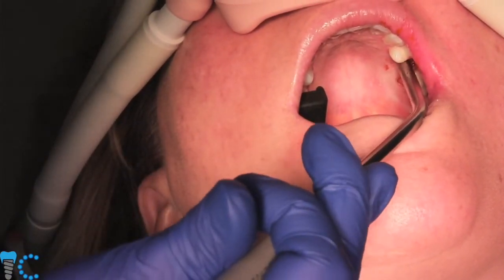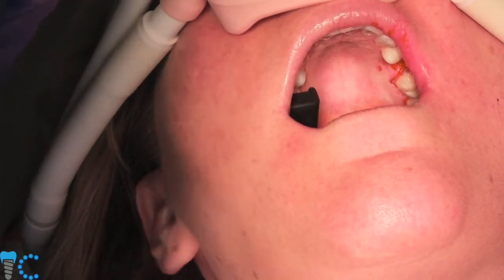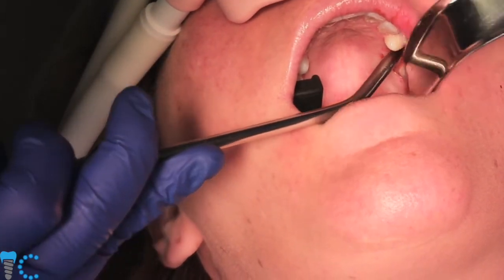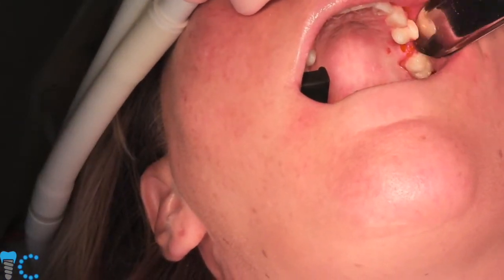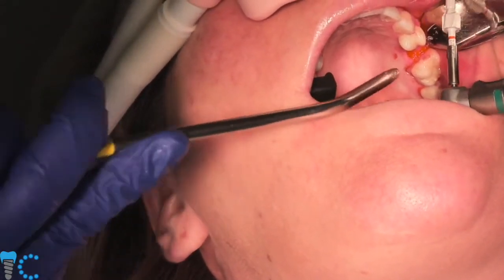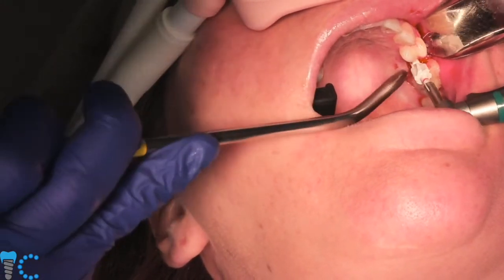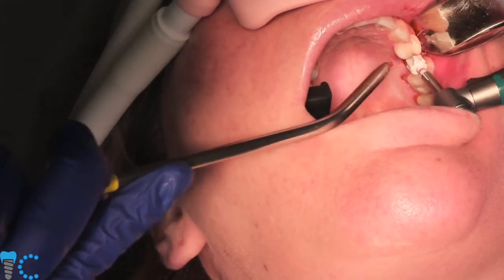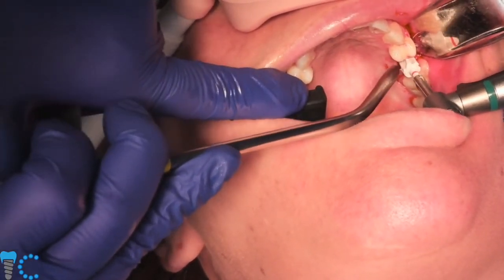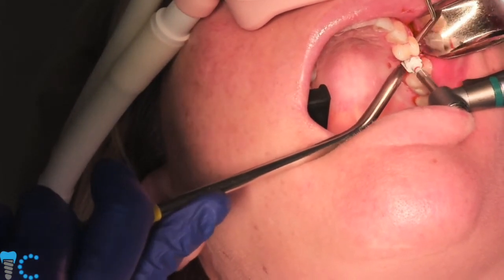In fact, we've placed a lot more now than we did then, because the system's in its 5th generation. As far as placing, using ceramic drills, we've used ceramic drills ever since 2004. Oh, so you started with ceramic drills before you started with ceramic implants? Yes, there was another company that had ceramic drills. I believe they got those in 2004. And yeah, we've enjoyed our ceramic drills ever since then.